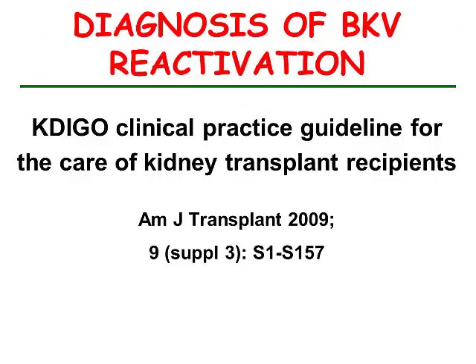How can BKV reactivation be diagnosed? So again, we go back to a KDIGO clinical practice guideline, which has been published in the American Journal of Transplant in 2009. We always, as you have seen yesterday, use guidelines, in spite of the fact that the experts always criticize guidelines. And you will see that today I also will criticize these guidelines a bit.